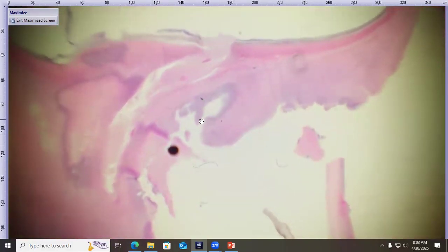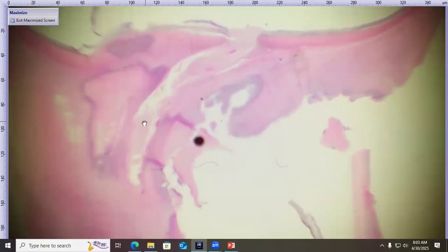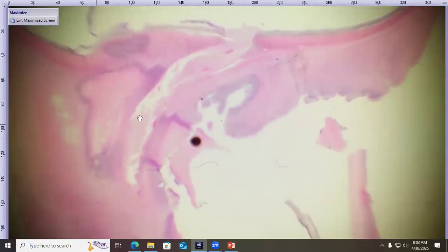Then as we move back into where there's that tan tissue, kind of in the orbital region, there is indeed tan tissue. And there's kind of these areas where there's more purple, so increased cellularity, and they're kind of outlining these well-demarcated zones. So we'll look at those a little more closely. And there's also these little cavitated regions that also look somewhat more cellular, so there's more purple. And then right here, this is our optic nerve, so we did catch that in section. So let's look at this more closely.